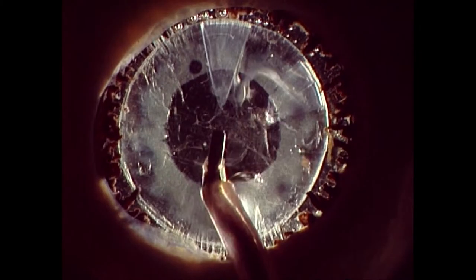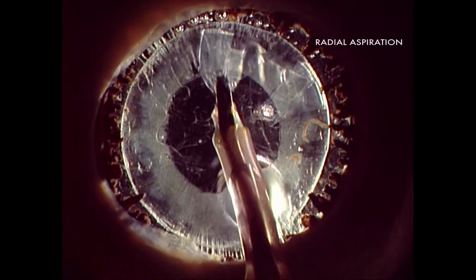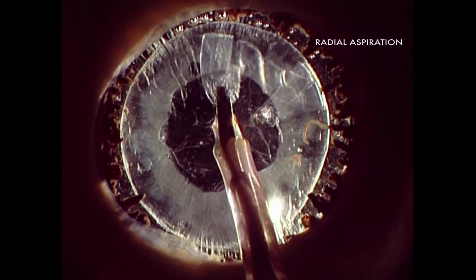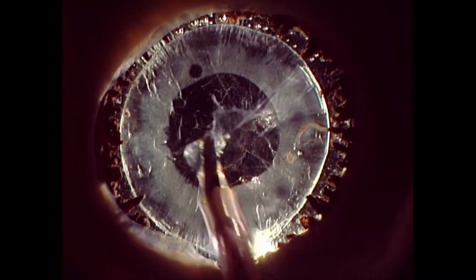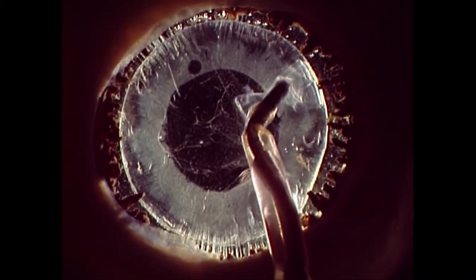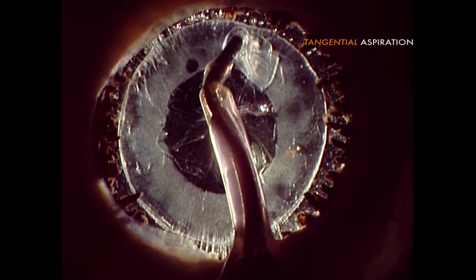This image illustrates both approaches to aspirate cortical material. Look at the zonules and the bubbles' movements. Look how gentle the releasing of the cortex is during tangential mode.